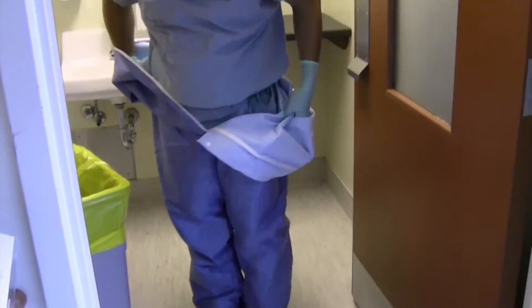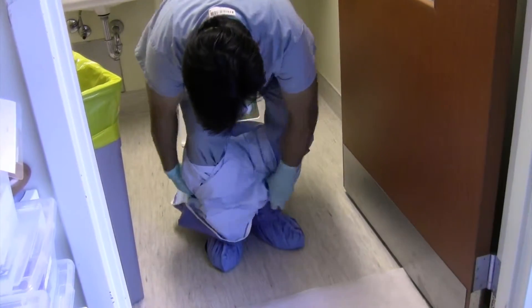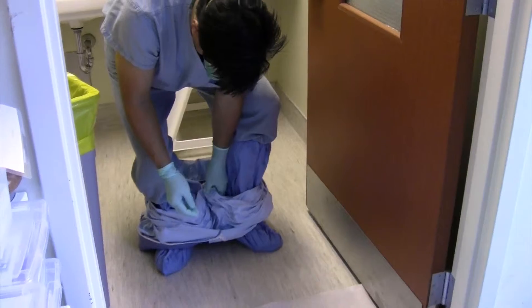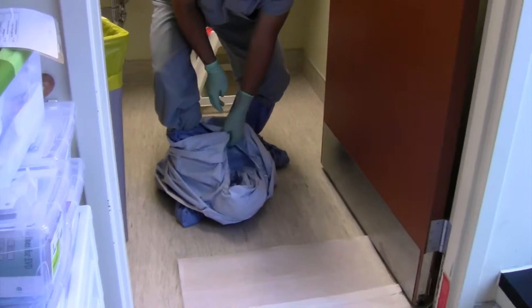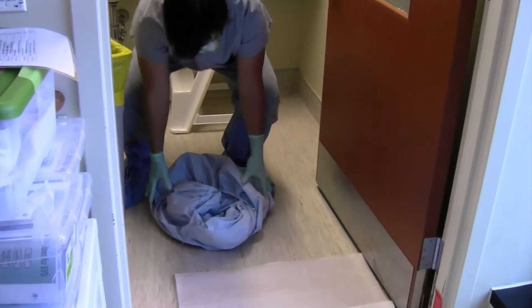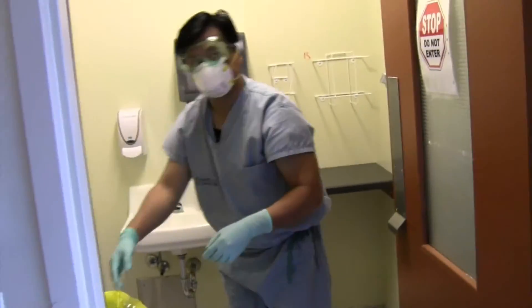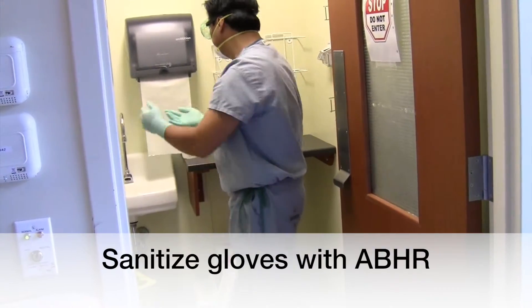Begin to roll the coverall down inside out towards the floor. Remove the coverall from your feet by pulling over your heel and pulling your foot off. Repeat with the other foot. Discard your coverall, then sanitize your gloves with alcohol-based hand rub.